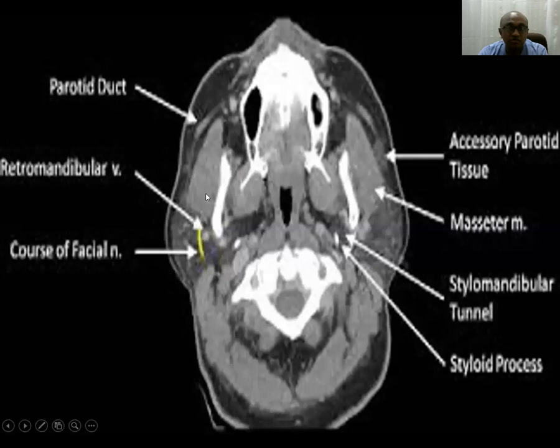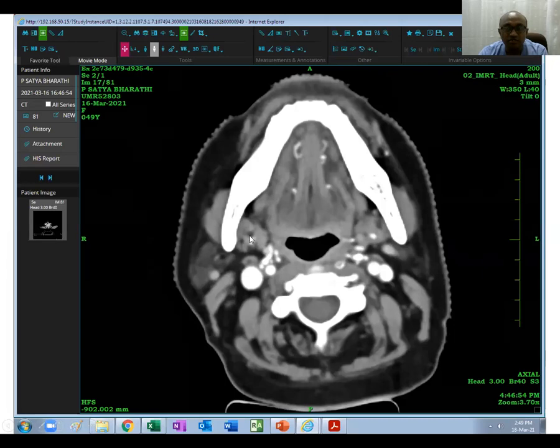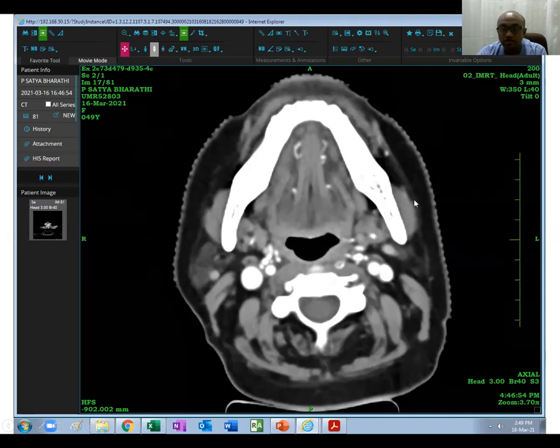You can see the masseter muscle here. This is the cervicofacial nerve, this is the retromandibular vein, and this is the external carotid artery. Let's see slice by slice. Going from down to up, you will see the parotid gland here. The anterior extension of the parotid gland is known as the accessory parotid gland. This is the retromandibular vein.